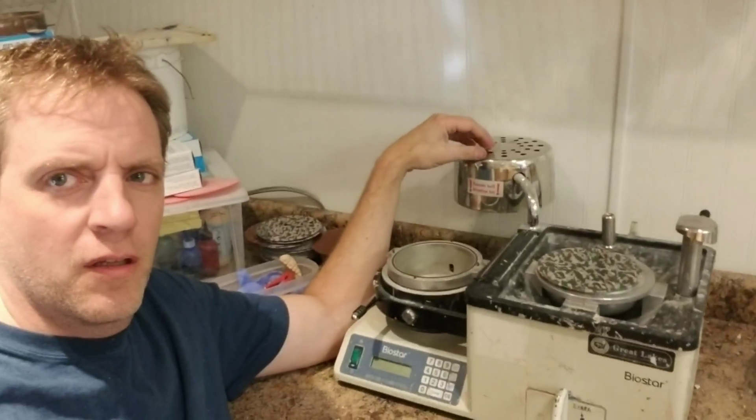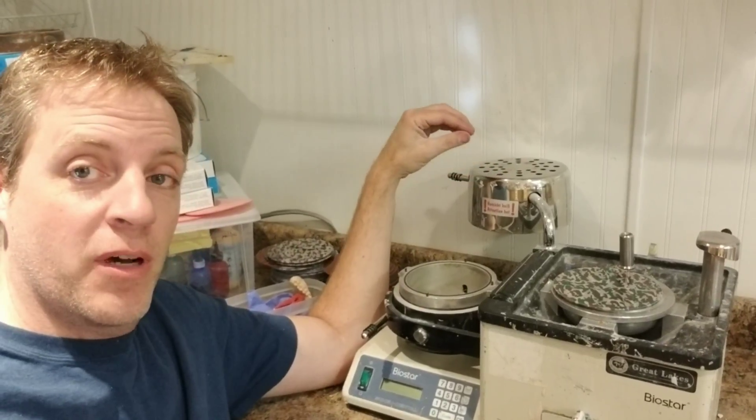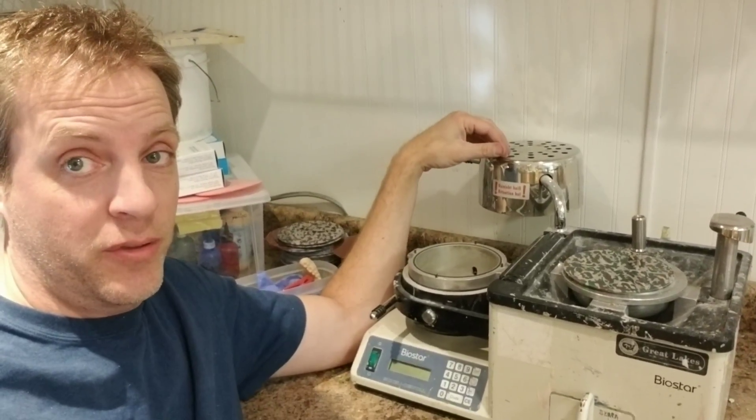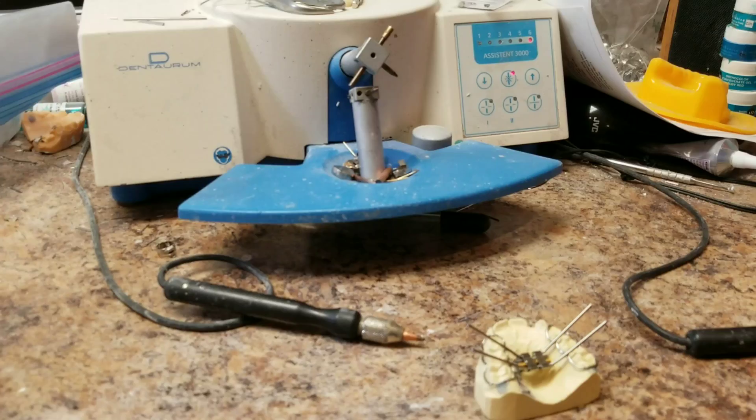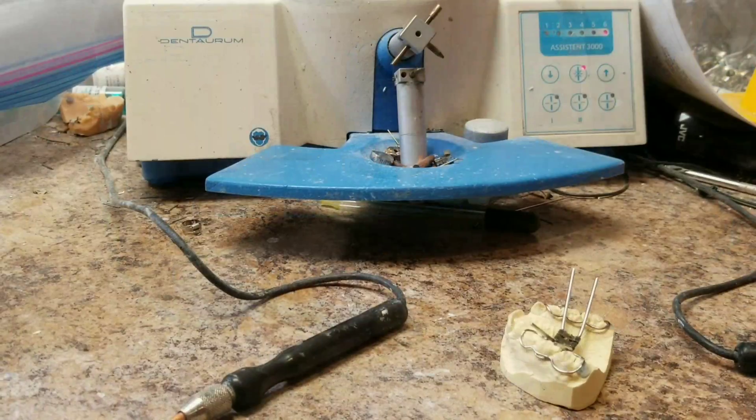For the record, nobody asked the 'are you single' question. Next question: what would be your best investment in the lab? This is one of two of my prized possessions in the lab. It just about does everything - I can't think of too many things it doesn't do. And this guy is also a fan favorite - the Dentaurum Assistent 3000 spot welder. I've made a bunch of videos using this piece of equipment.